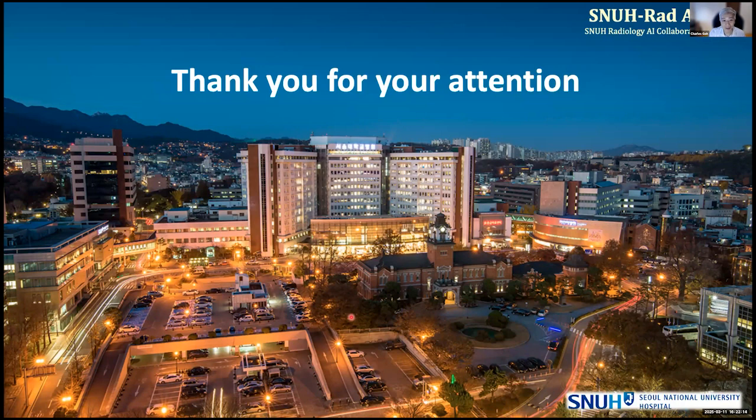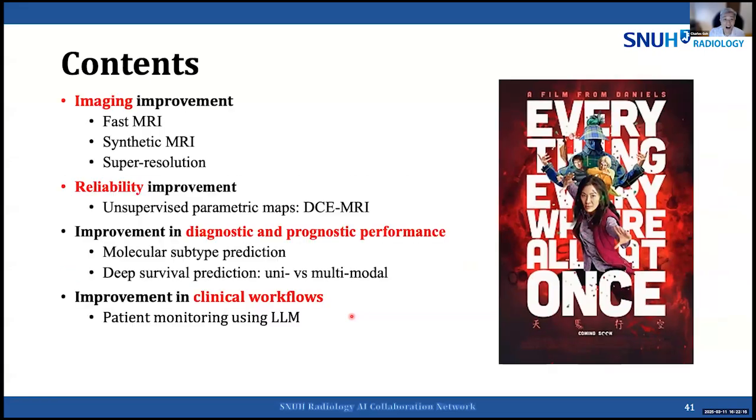But can I ask one question that I'm always curious about? Out of all the things that you presented today, how many of these techniques are you actually using in clinical practice in SNUH in your department?